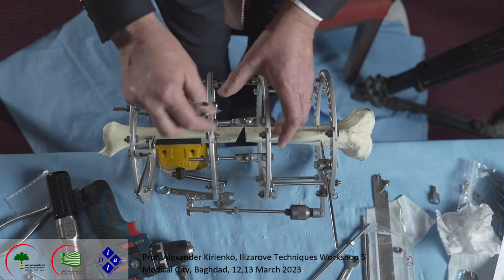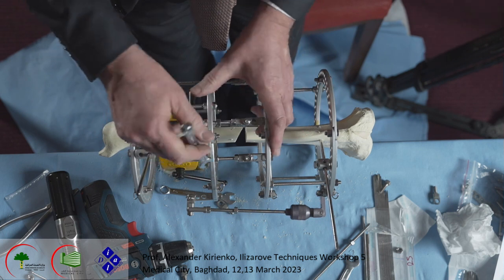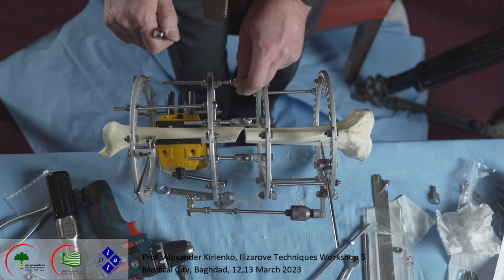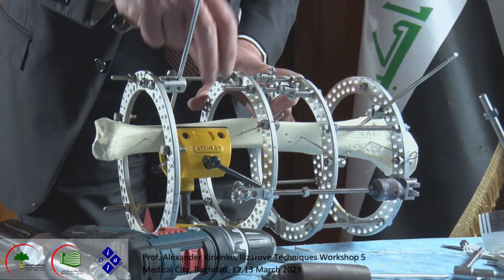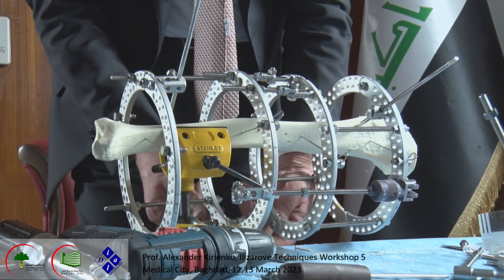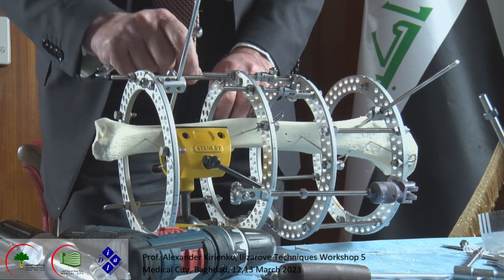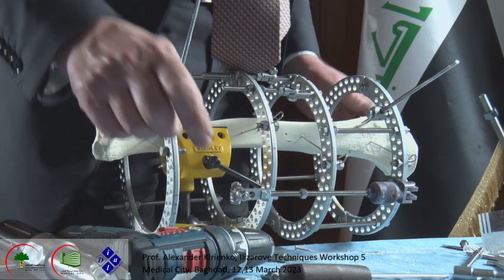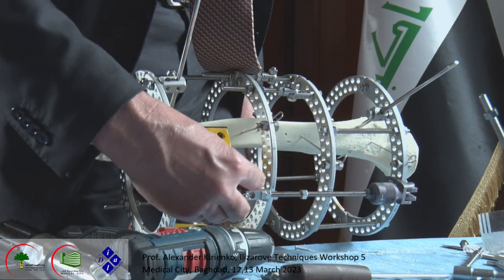and the bones touch one another. Like this. Compress. Okay, now it's perfect correction. No lengthening, only correction of deformity. Okay?